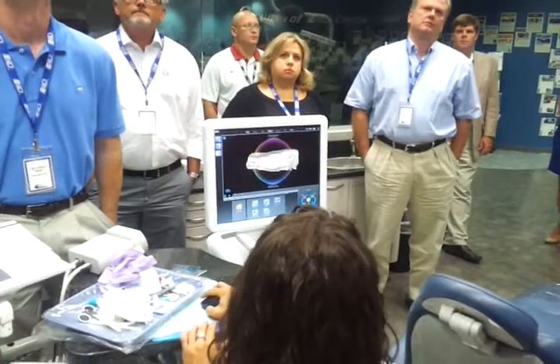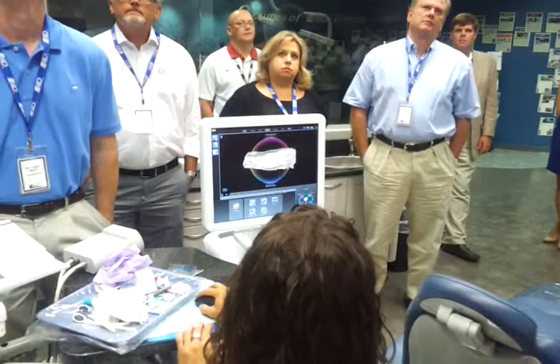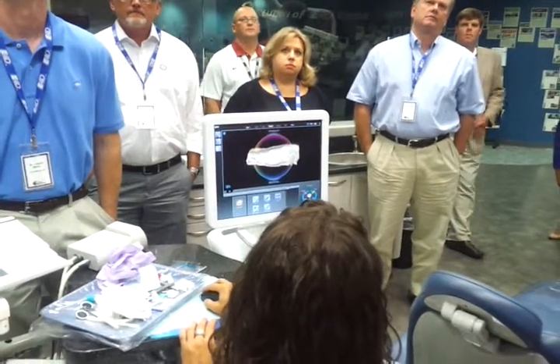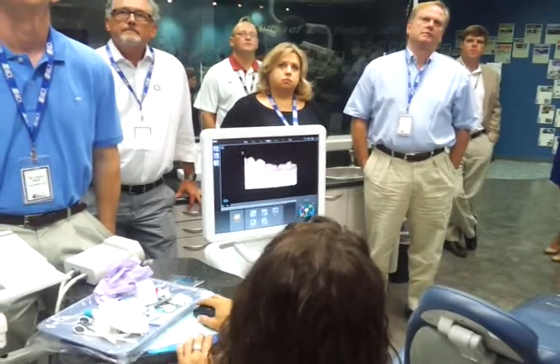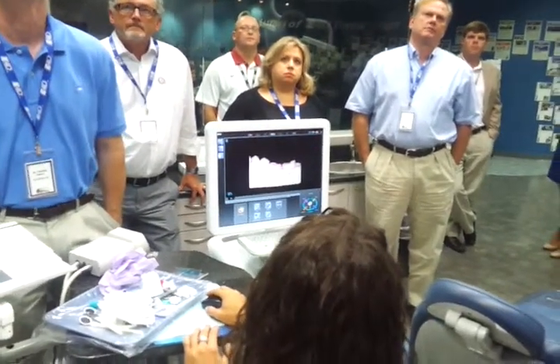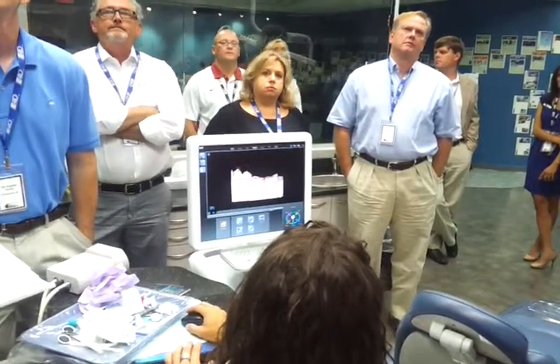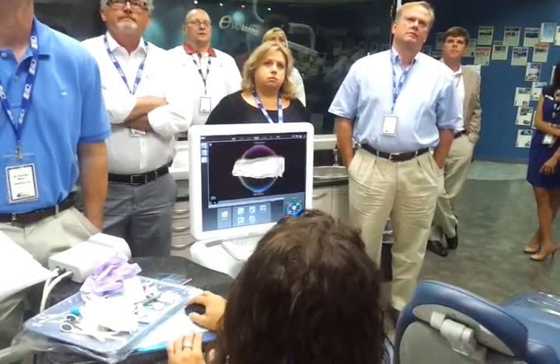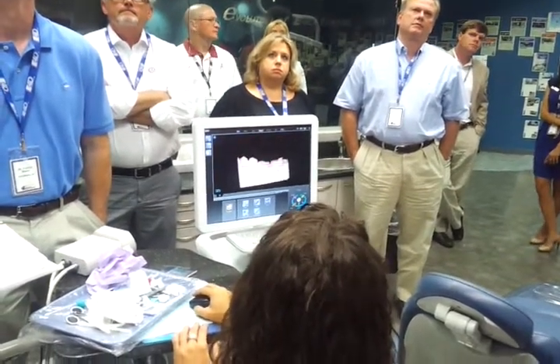So right now, my system's saying I'm on tooth number 19, so I'm setting the orientation for tooth 19, taking into consideration cusp tips and occlusal grooves here, and then I'm going to take a look at it from the buccal perspective. What I'm looking at from the buccal perspective is I just really want my marginal ridges to be even, the occlusal plane. This is not correct, so I need to take this tooth and pull it down. Just tip it down a little bit, double check again from my buccal perspective.